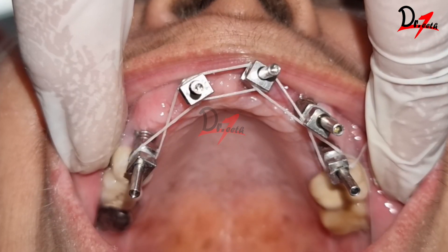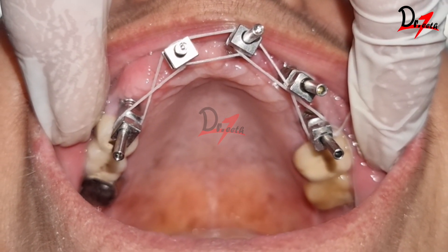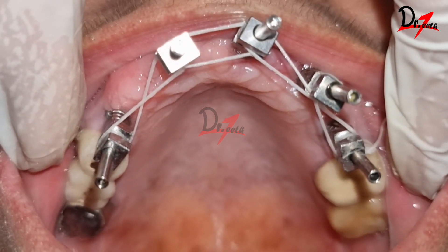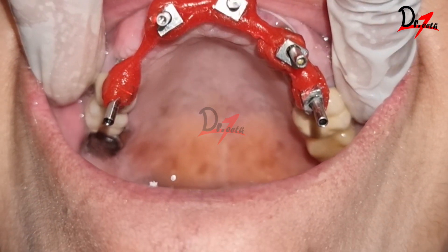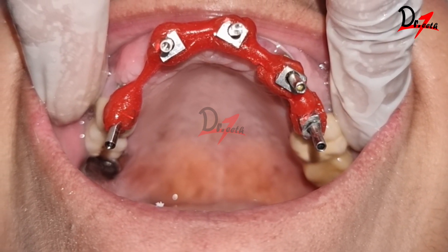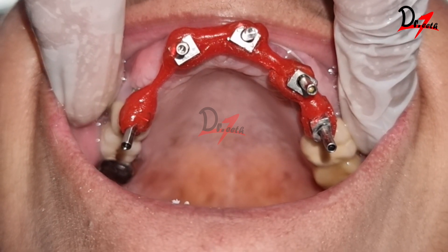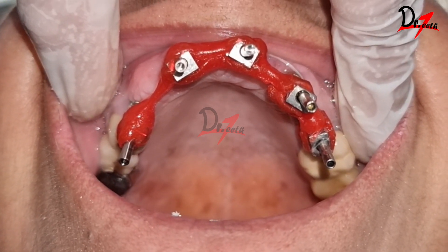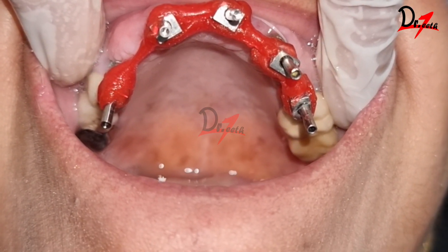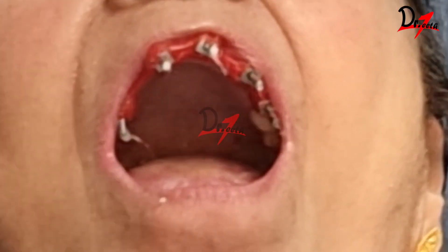After this, we will splint or join the impression copings together using dental floss. This will help us stabilize the pattern resin that we have to use. In the next step, we will use the pattern resin to splint all the impression copings together. After this, we have to section the framework at multiple areas and reline it with fresh pattern resin. This is done because there is some amount of polymerization shrinkage of the material, so to avoid inaccuracies, we will do this.